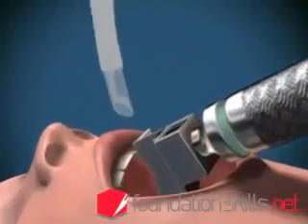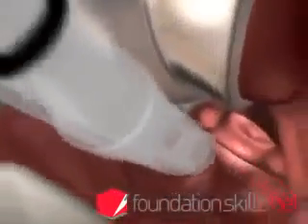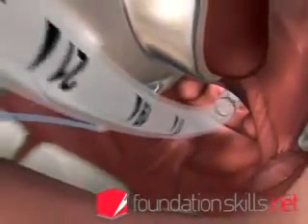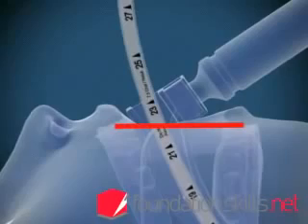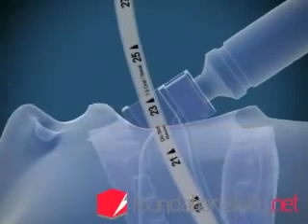With the right hand, insert the endotracheal tube from the right-hand side of the mouth directly between the cords and into the trachea until the cuff passes through the cords. The markings on the tube at the incisors will show between 21 and 24 centimetres in the average-sized adult when the tube is in position.